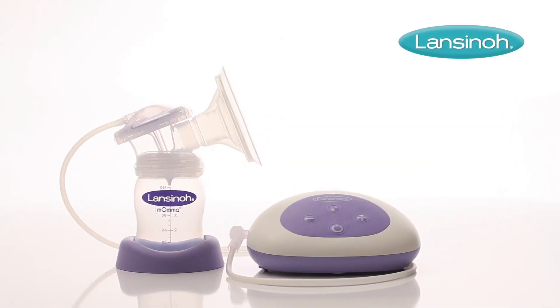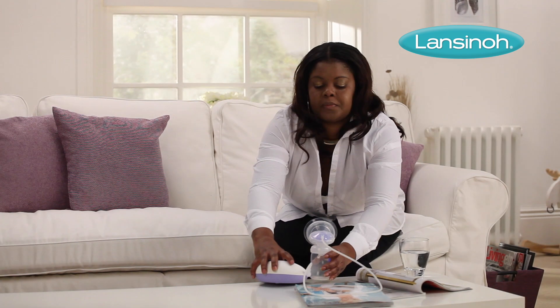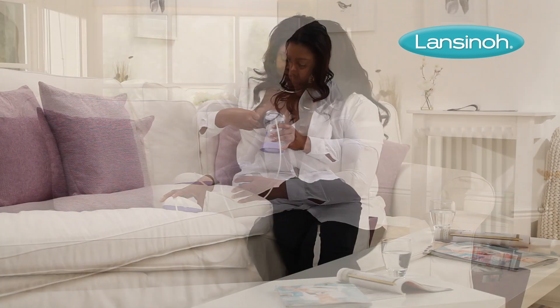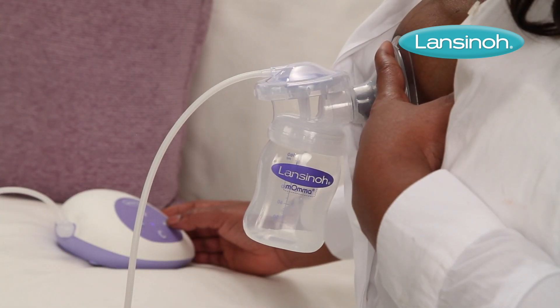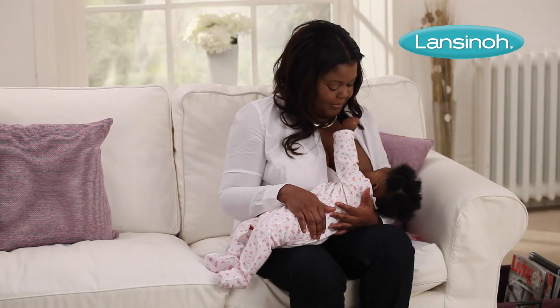Our single electric breast pump has been specially designed to enable mums to express quickly and easily, so that breast milk is always on hand whenever you're away from your little one, so dad can enjoy a little bonding time too.